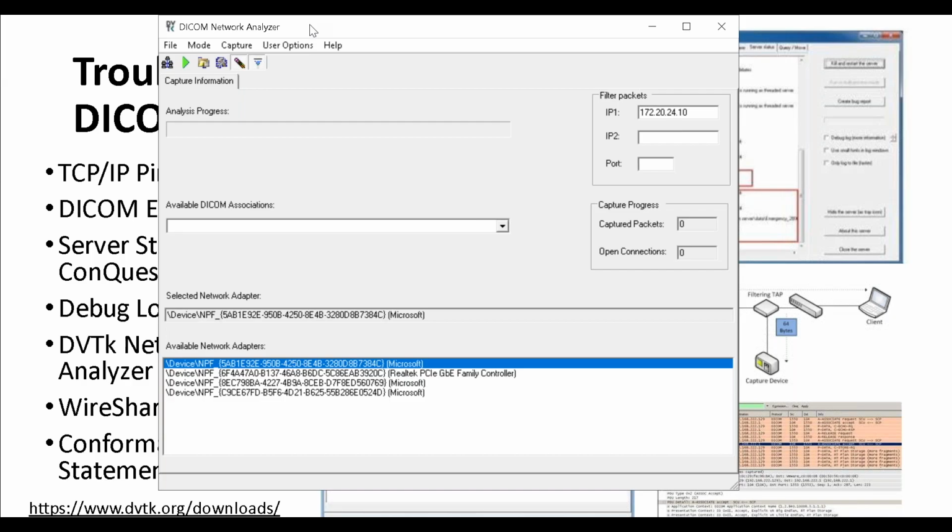Problem with the switch, if you don't have a programmable switch, you can't make this work. What I'm going to do here, notice it's got a target IP. Let me zoom in again. Where's my magnifier? Got a target IP. You can say this machine, listen to this port, or listen to this port. You can tell it to go ahead and start capturing. It'll capture a DICOM association. It'll say, hey, I've got this DICOM association, and then you can literally just pick apart the exchange. And this is really important when you've got that stubborn machine that will just not communicate.